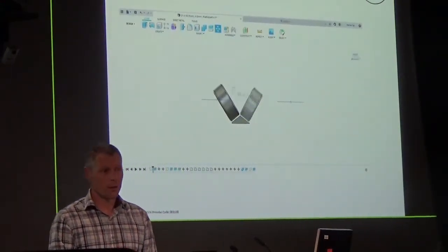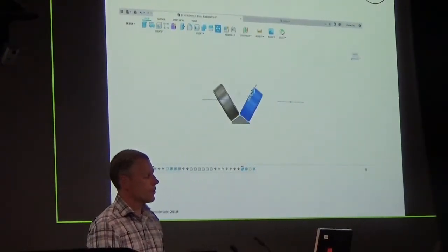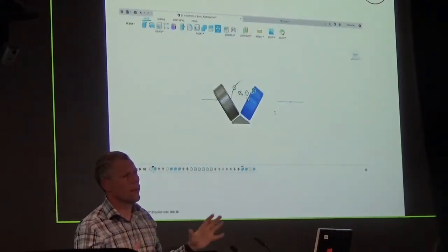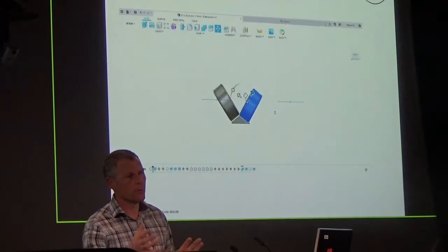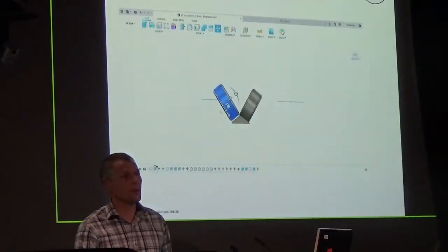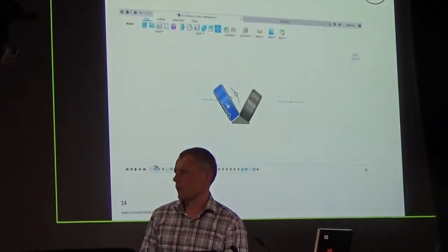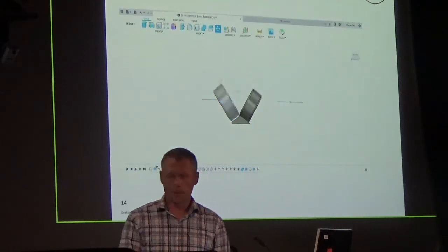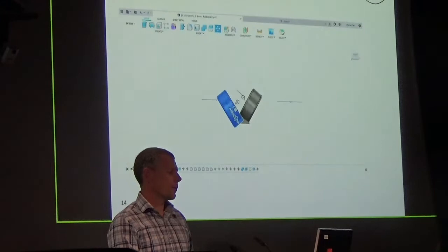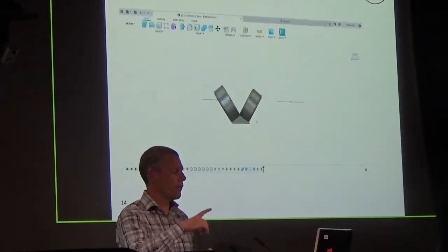That's me doing this, and having to play around with this and getting them to the right position that they need to be. There is no sort of algorithms or anything like that, which would be the next step. So a software that literally does this for you. And it means again that the person's finger measurement can be typed in, and then you end up with a splint that looks pretty much identical to the one that we had in the previous shot.